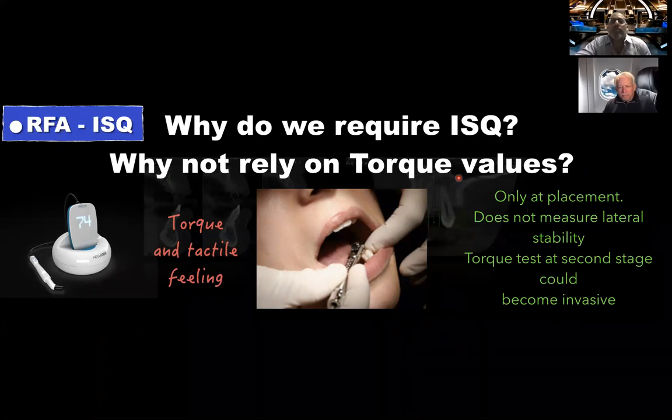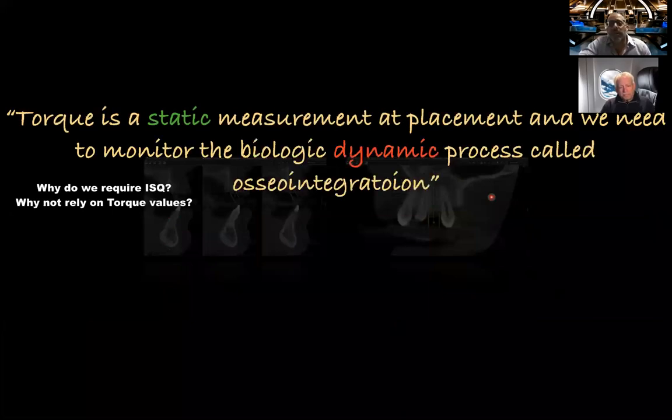For those of you who have reverse torqued your implants to see if they're ready, when we reverse torque and pull an implant out, the game is over. Or maybe you push it back in, say a little prayer, and hope that it will integrate. So it's a very invasive way. Torque is not the measurement of choice for us to monitor.